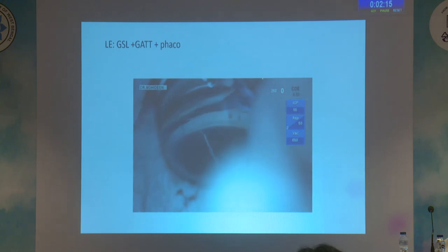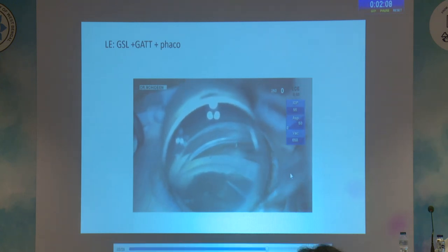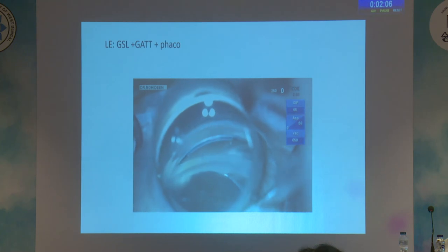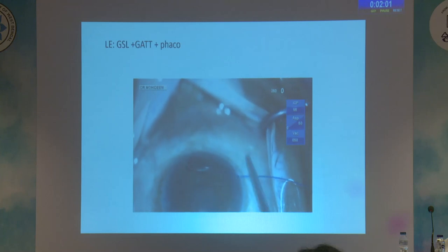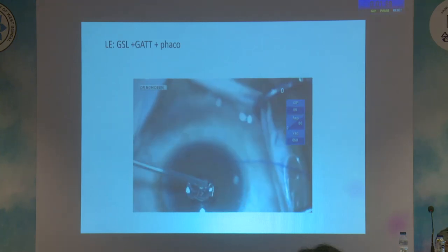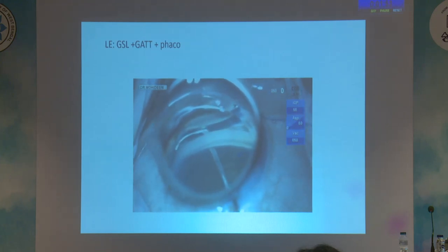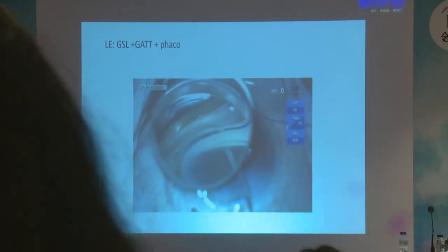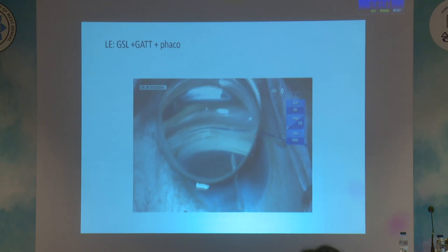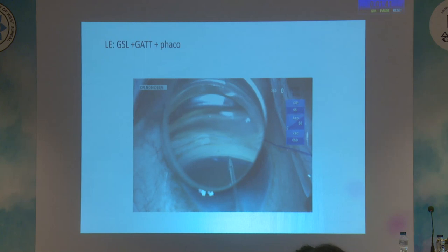The goniosynechialysis was achieved using a Tenito microhook. The Tenito microhook is introduced through the paracentesis and gentle goniosynechialysis is performed. After achieving the goniosynechialysis, the blunted Prolene tip is introduced and goniotomy is done. The Schlemm's canal is exposed in the nasal quadrant and the Prolene suture is threaded and the procedure is performed.